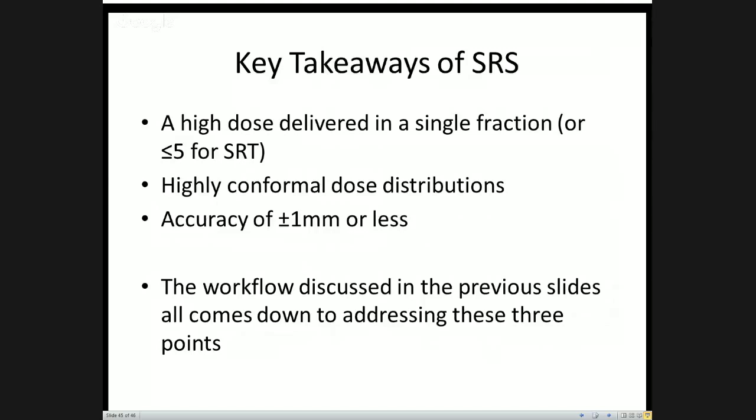So we'll repeatedly deliver some amount of dose, allow the healthy tissue to repair, and then hopefully we can eventually take that cancerous tissue down to 0. In the case of treating a met, which is what we're doing in SRS most of the time, we're just delivering a single ablative dose, and so we want to make sure to capture it all right then.